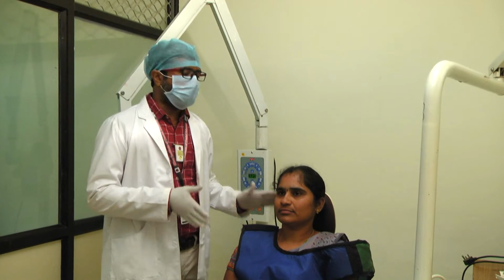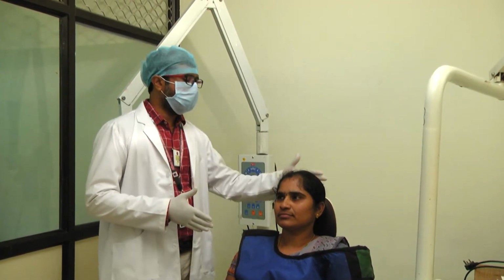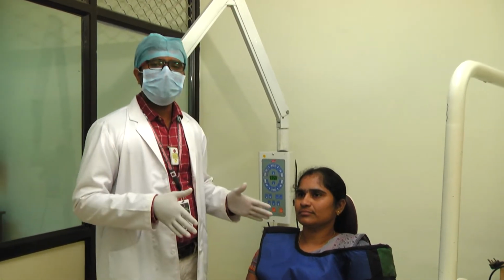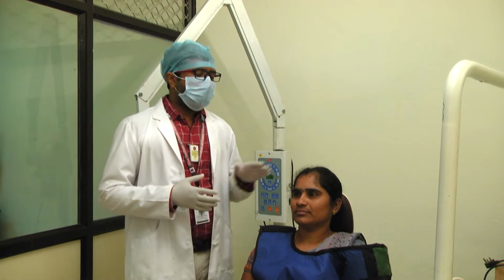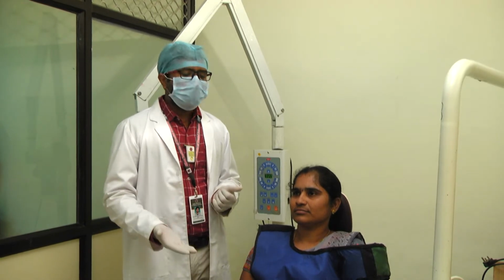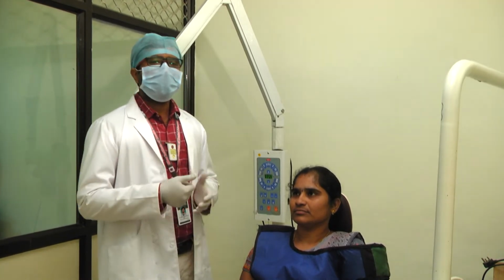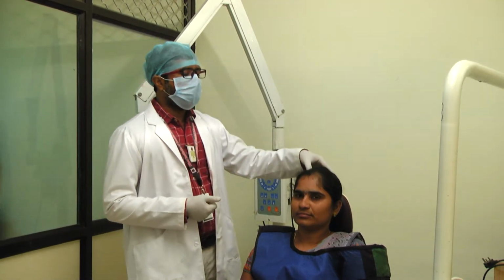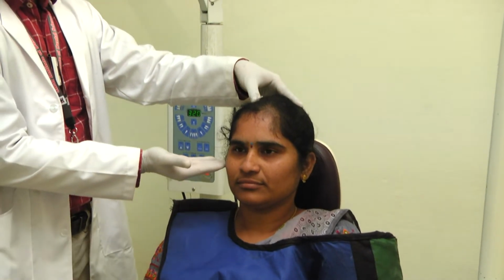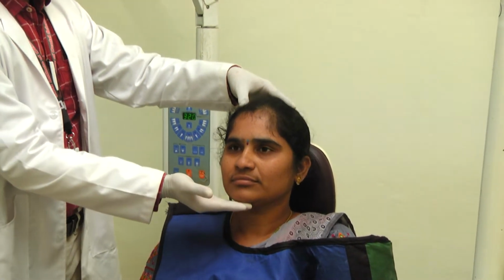When the patient is seated, make sure the head and back are rested and the patient is in an upright position. Always briefly describe the procedure to the patient, what is going to be done. For maxillary teeth, lower the chair as low as possible, and for mandibular teeth, slightly elevate the dental chair. While taking a maxillary radiograph, make sure the mid-sagittal plane is vertical and the occlusal plane is horizontal. For mandibular teeth, slightly lift the head in order to compensate for the changed occlusion when the patient opens the mouth. These are the first fundamental rules to be followed.